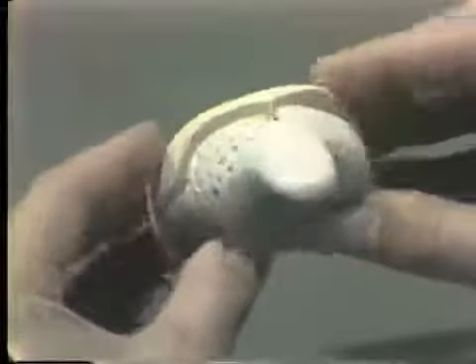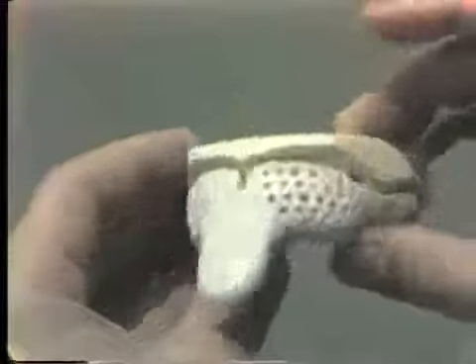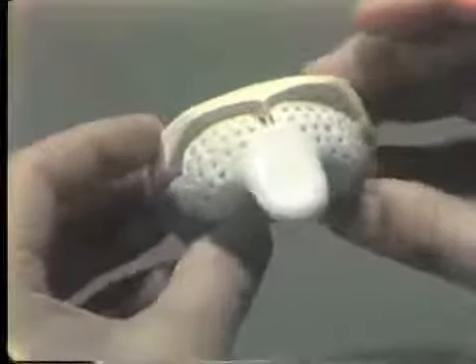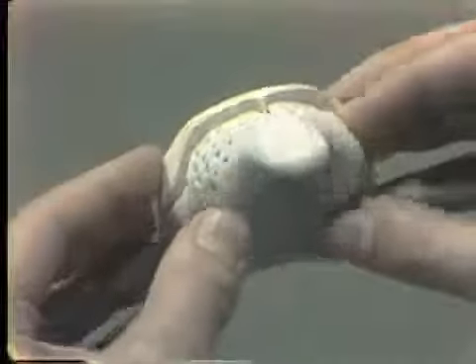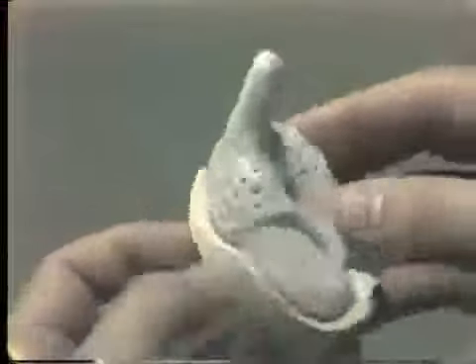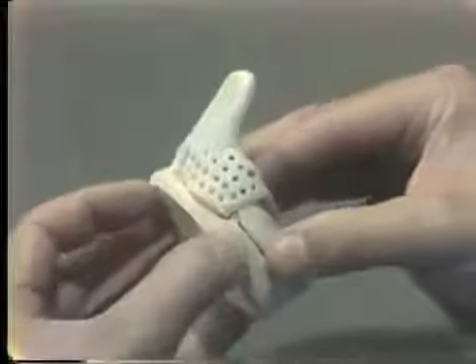A tray of this design will ensure that the labial anterior vestibule area will be accurately recorded with no bubbles or voids. This is very important in a maxillary immediate denture. Usually, after the alginate sets, these two trays will come out of the mouth in one piece.